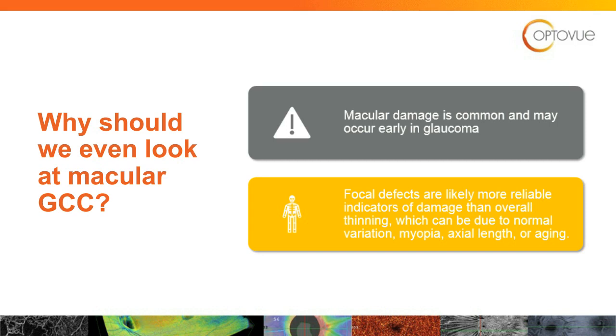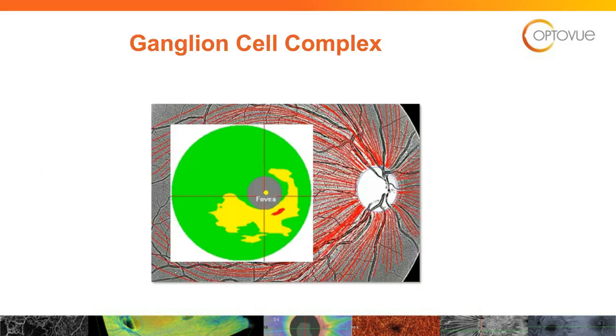They're both important, but we know that glaucoma can affect in a focal way, an asymmetric focal way. And so because of those two reasons, looking at the macular ganglion cell complex is important. And if it's affecting areas close to the macula, it's going to impact that patient's quality of life. So we're really hypersensitive now, using the ganglion cell complex scan to recognize damage when you see it and intervene appropriately to preserve as much central function as possible.